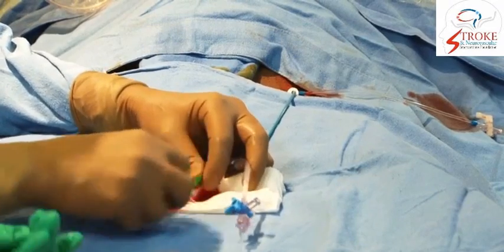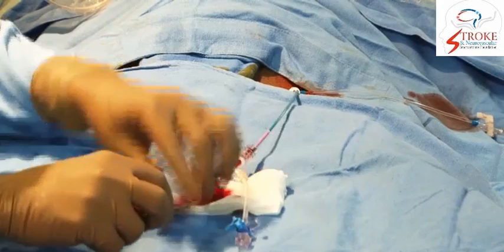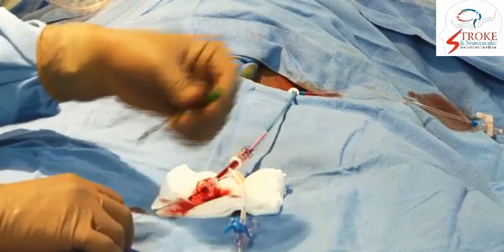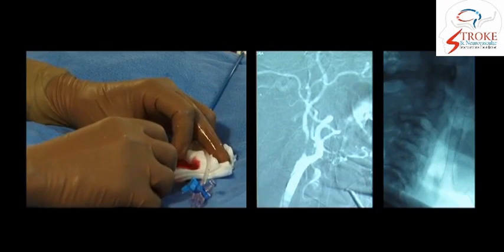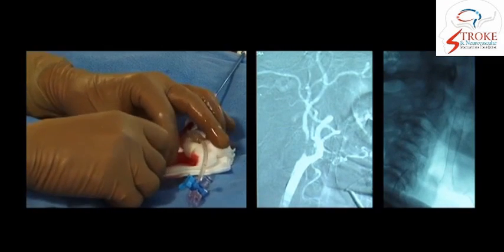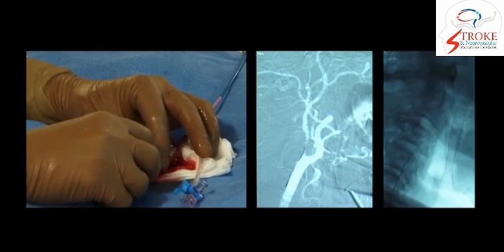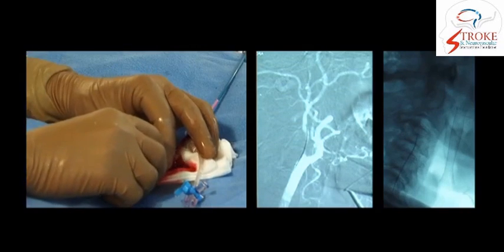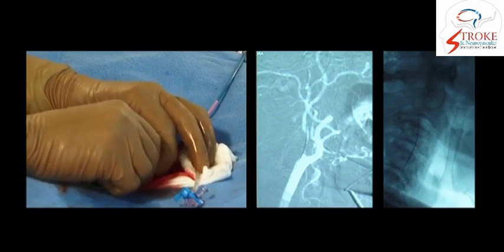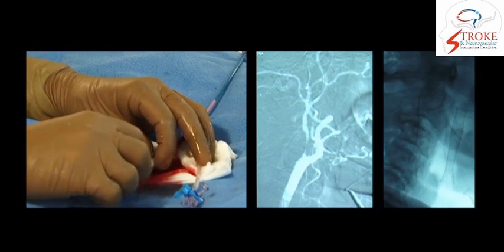Using an introducer, we are placing the filter device into the guide catheter, introducer being removed. There is a constant flush going through the guide catheter in the procedure. Now very carefully the wire is being taken across the stenosis. You see it passes very freely and easily. The gentle curve has helped us. It is being taken into the upper part of the cervical ICA up to the petrous ICA.